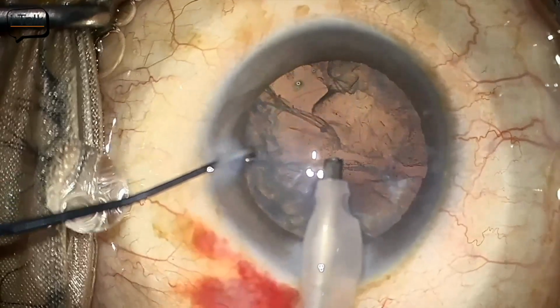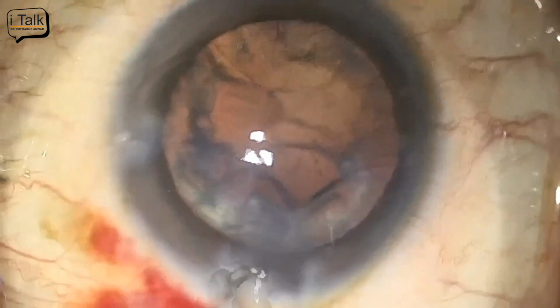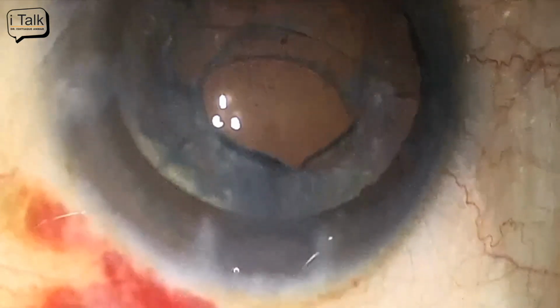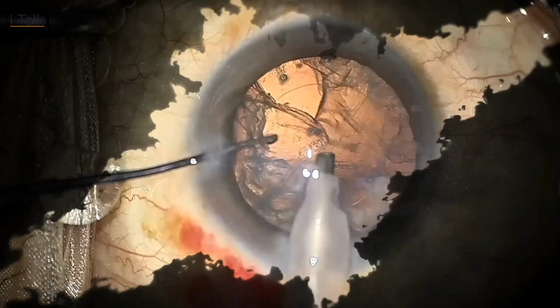You can see that the posterior capsular tear is there, and when the surgeon wrongly takes it out, there's a vitreous loss. So this shows that posterior capsular tear and vitreous prolapse are two separate entities.